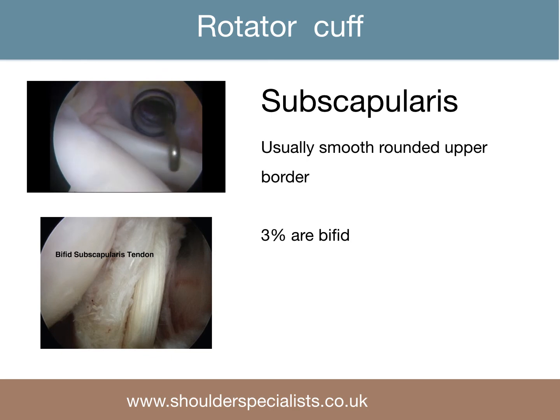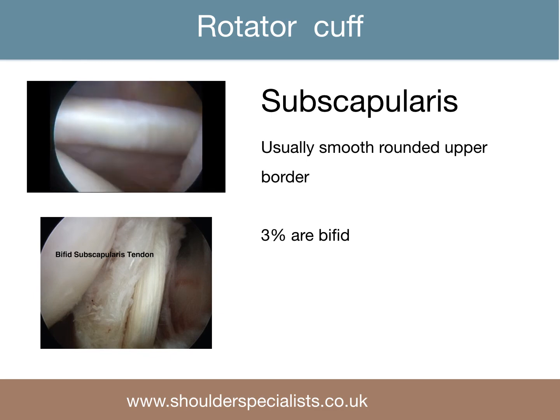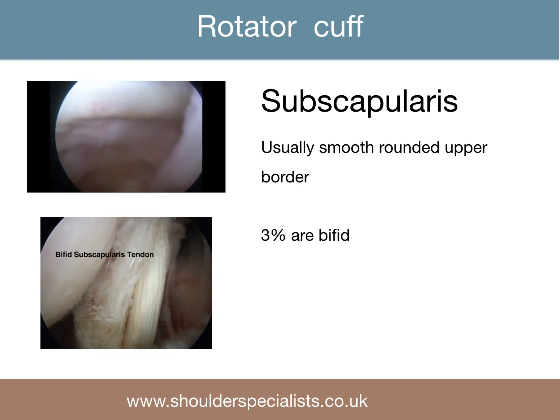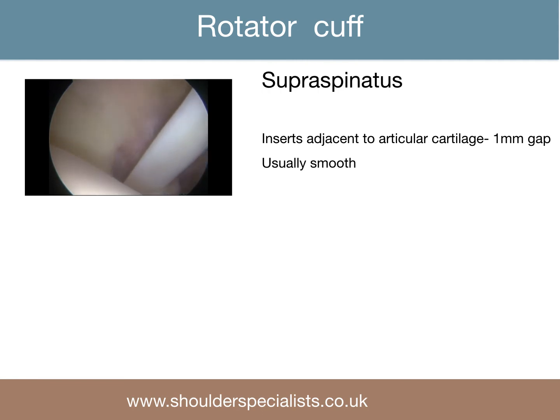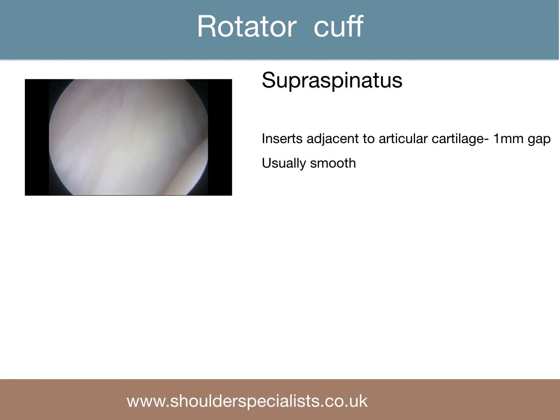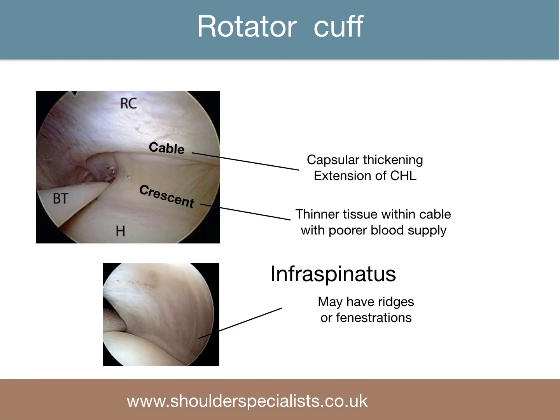The rotator cuff also demonstrates normal variation. The subscapularis tendon may be bifid in 3% of cases. The supraspinatus insertion is usually smooth, with up to a millimetre gap between it and the edge of the articular cartilage. The rotator cable is a capsular thickening and is an extension of the coracohumeral ligament. The crescent is the thinner cuff tissue contained within the boundaries of the cable, and is the part of the cuff with a poorer blood supply. Finally, the infraspinatus will often have fenestrations or ridges.